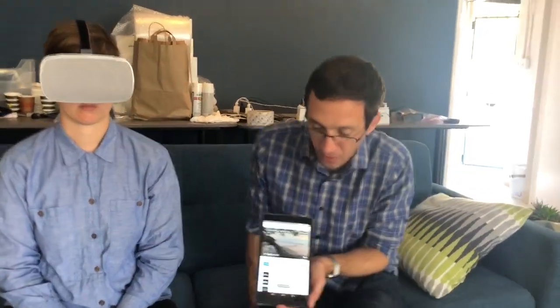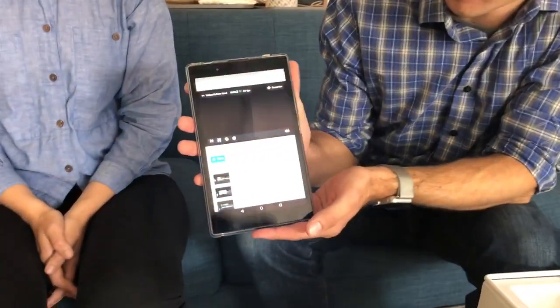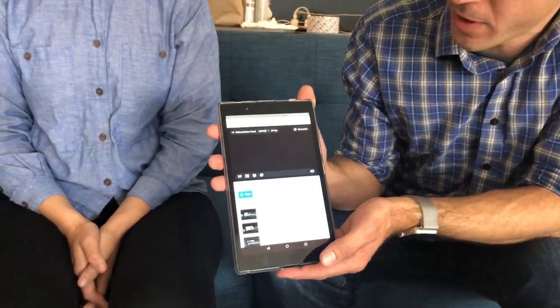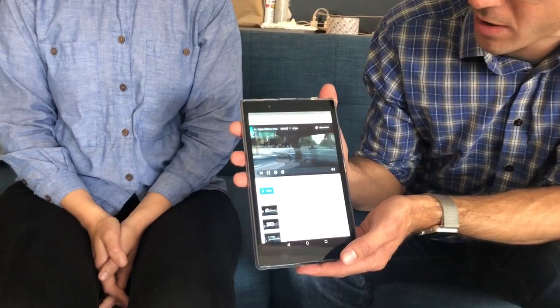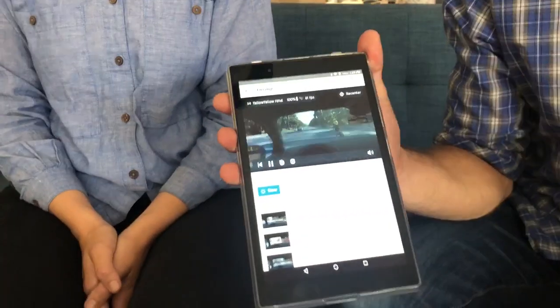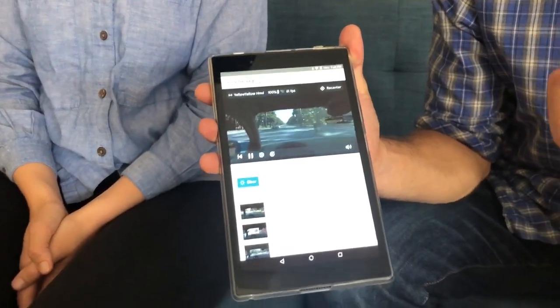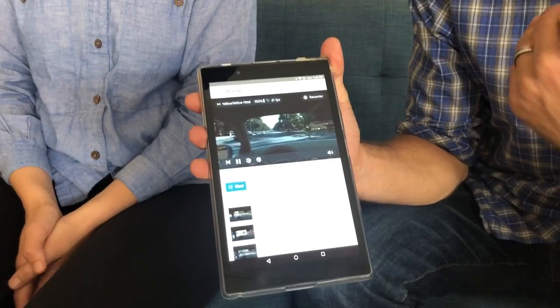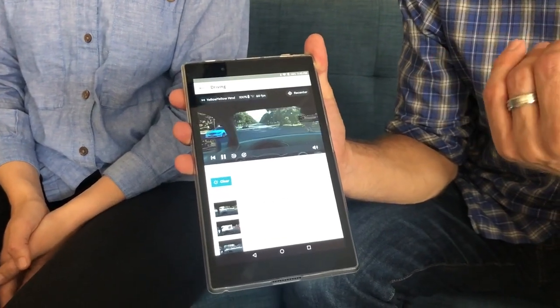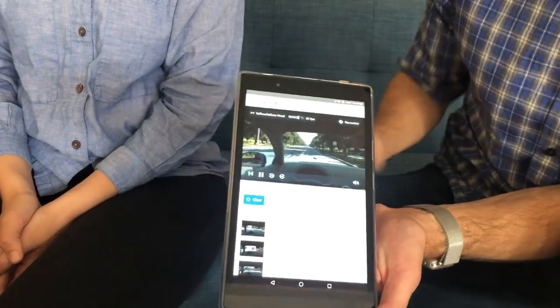Here, I'll take her for a short drive. So now we're putting Mila into a virtual car, and this is not far from Stanford, and she's going for a short drive. And this is an experience designed for people getting over driving accident trauma. They might have developed a fear of driving over bridges or under tunnels. It's very common for veterans to experience a fear of driving.